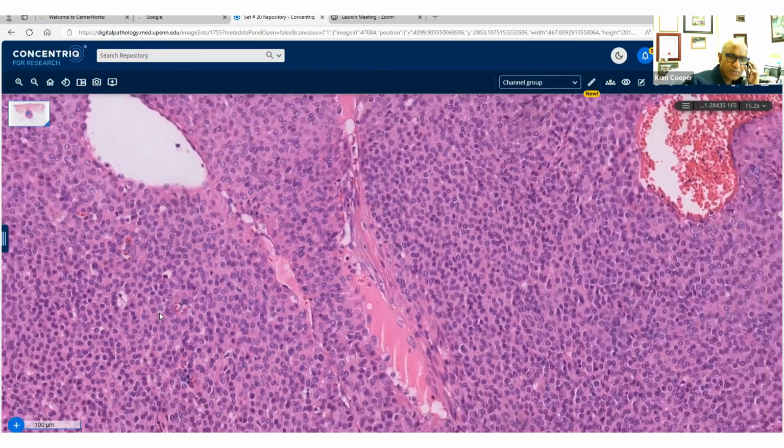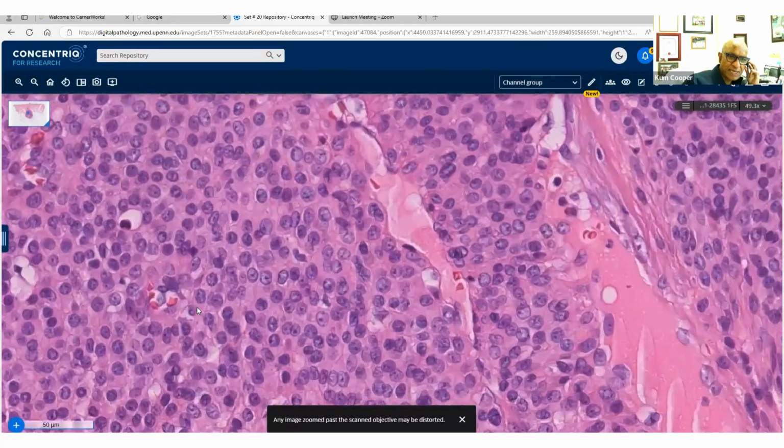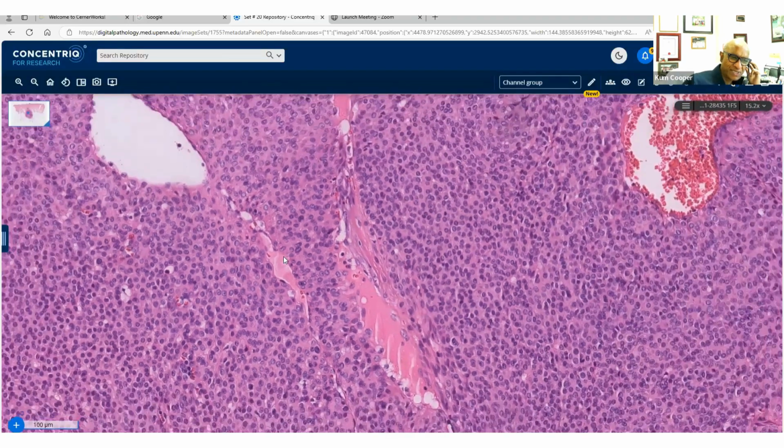And looks like glomus. Yes, it is glomus. Correct, it is, and that's a morphological diagnosis, because there aren't many immunostains to help you in this regard, except for actin, which stains that. So it's a pure morphological diagnosis. And the question is, why am I showing you this?